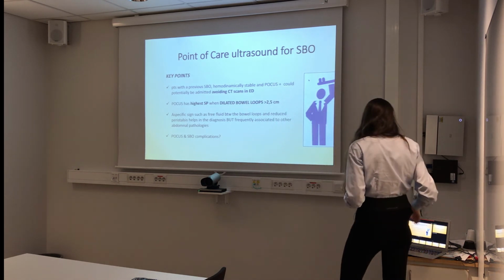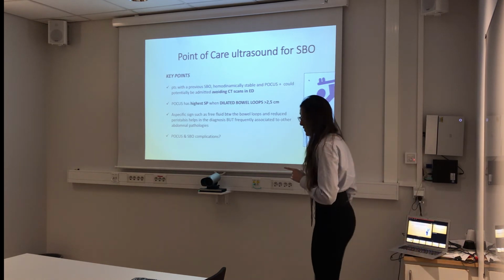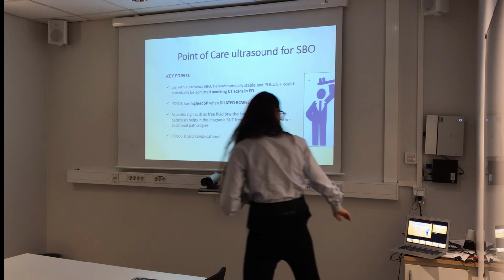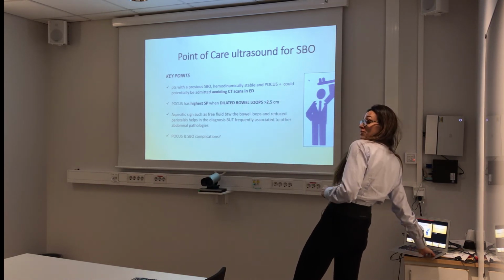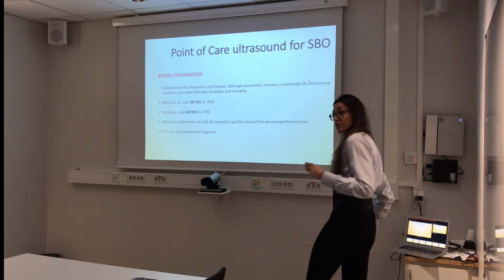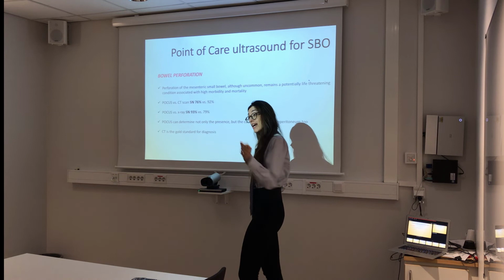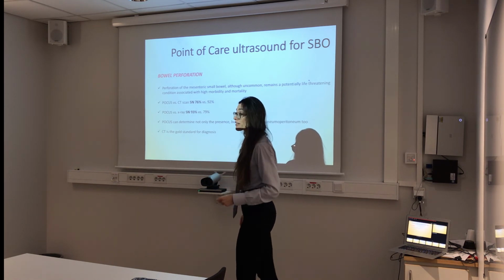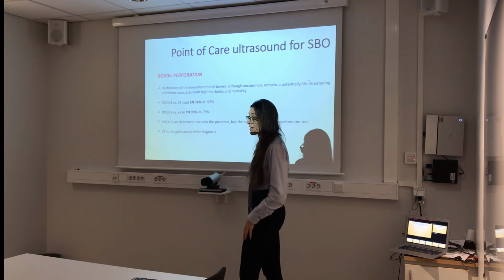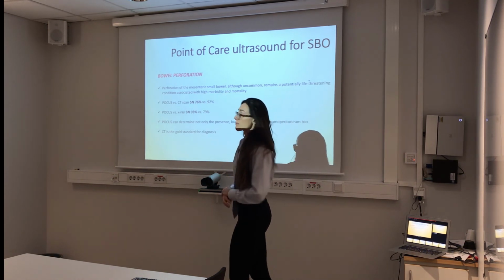POCUS and SBO. Last two things, two pearls, complications. I thought about this because I have two patients and I said, well, I should present them. A patient with a hernia can have SBO, and a patient with perforation as well because of SBO, because they wait like 48 hours and then they come here, because they live in a sheltered home and nobody looks at them, okay? They are not passing stools since 2 days and they can have this problem, perforation.